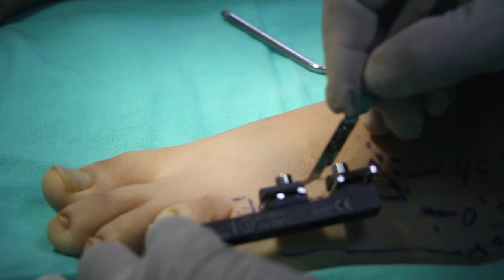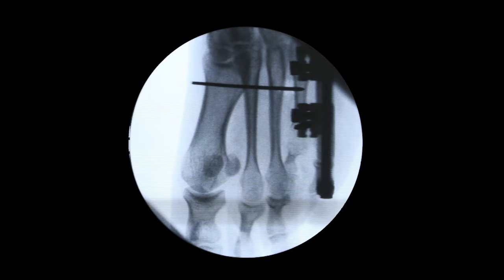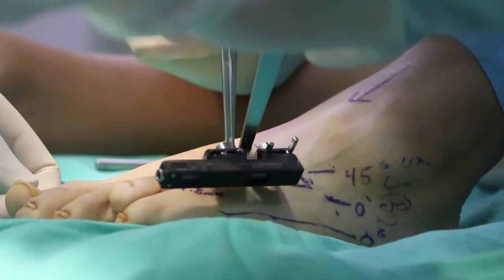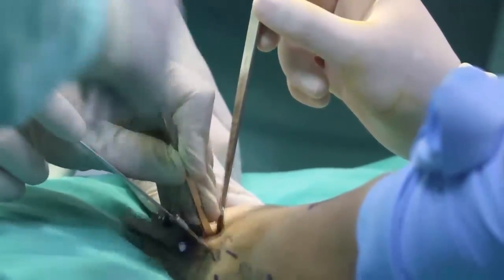After this, the skin is incised at the level of the 4th metatarsal. Careful dissection of the tissues is performed to avoid damage to ligaments, tendons, blood vessels, and nerves. This is the site where the corticotomy will take place; a Kirschner wire is used to perform multiple perforations, then completed with a small osteotome.